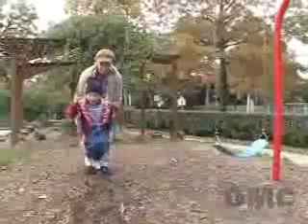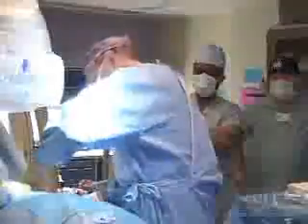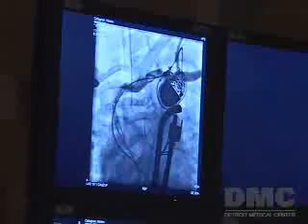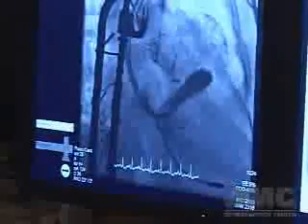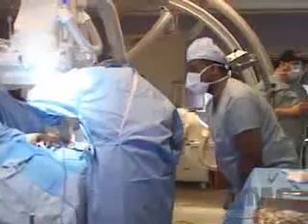So rather than have Trinity go through open chest surgery, Dr. Karpowicz opted for the new FDA-approved thin lead catheter delivery system. It requires only a 1.5-inch incision made to look like a skin crease near the patient's armpit. Using a catheter, Dr. Karpowicz slips the new lead into place and attaches it both to the heart and the pacemaker. Now, with the upper and lower parts of her heart communicating and working properly, Trinity's prognosis is good.